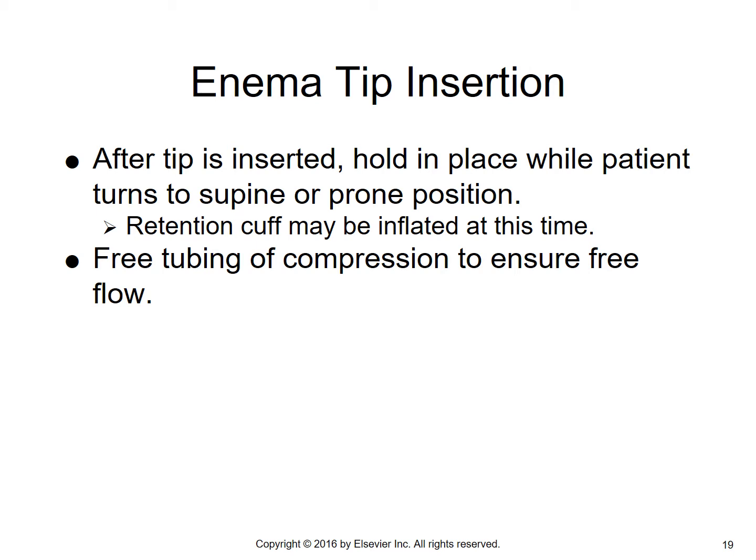One thing I'd like to mention, the enema tip is going to be in the patient. They're going to have a lot of apprehension. They're on their side, then you're going to tell them to lay on their back. You want to let them know that that enema tip is soft. It's going to bend. A lot of times that gives them reassurance that they can lay on their back. You want to free the tubing of any compression there might be to ensure that there's a free flow, so no kinks.